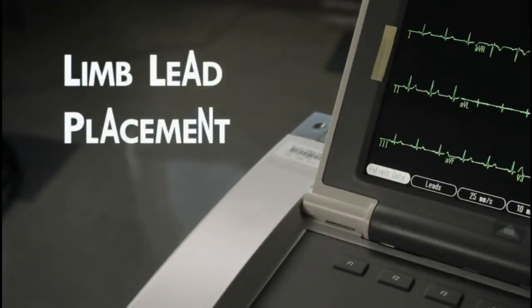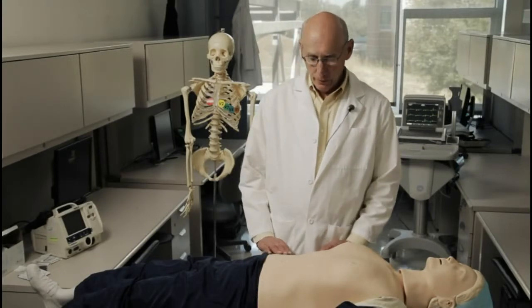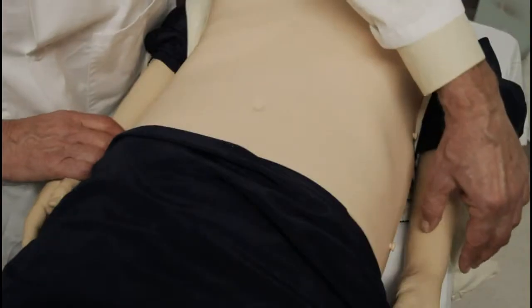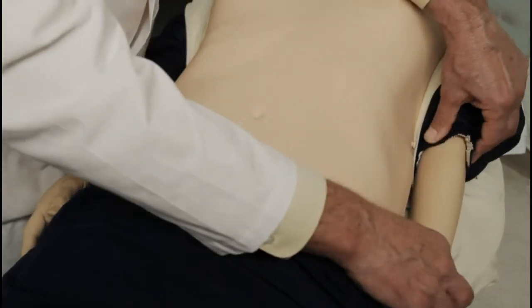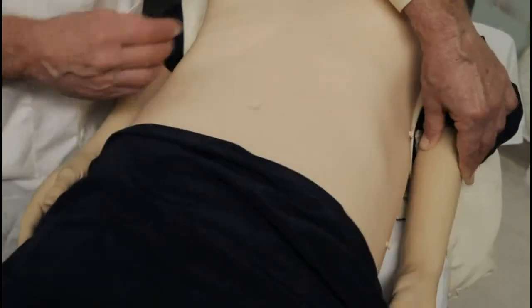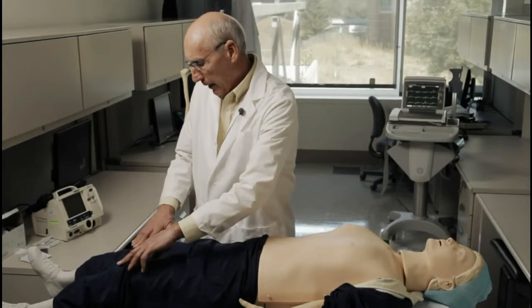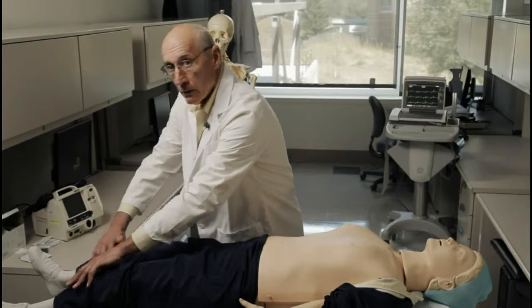Limb lead electrode placement is relatively easy. Have the athlete laying flat on a comfortable surface, with his arms relaxed at his side and the legs relaxed as well. Place the arm electrodes anywhere from the elbow to the wrist on the inner surface. Just make sure they're both at the same level and that the right electrode is on the right arm and the left electrode is on the left arm. Place the electrodes for the legs anywhere from the knees to the ankles, again on the inner surface.